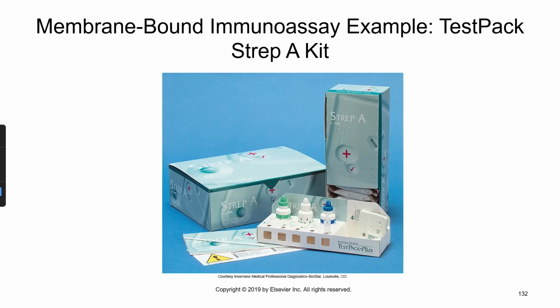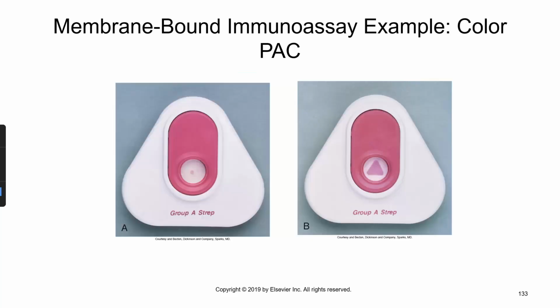And this is just an example of the Strep A kit. And another Strep A. This is a membrane-bound test system.